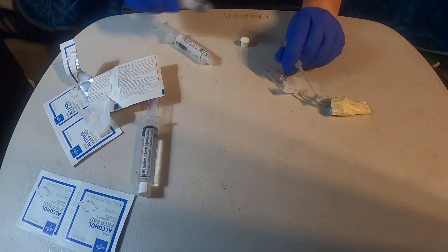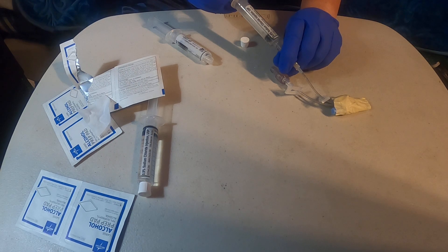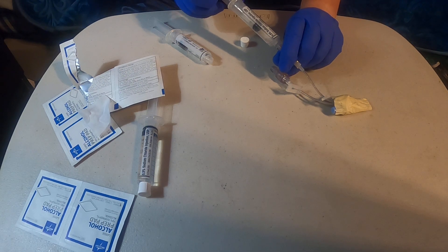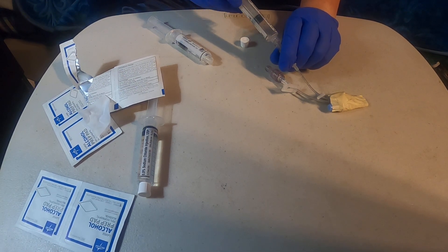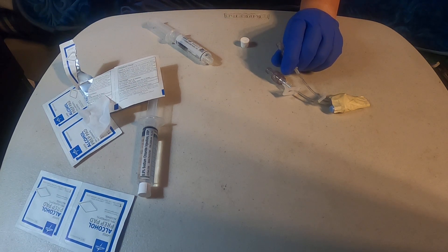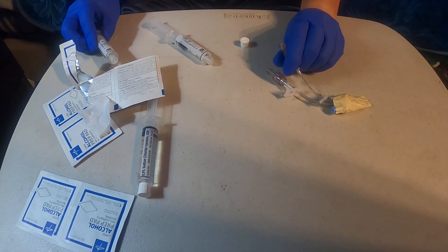Get an empty syringe and pull back about 5mls — that's your waste. You're not going to use this because it is contaminated with normal saline. If you're running a basic metabolic panel or a complete metabolic panel, that's going to cause issues because your sodium levels will be high.